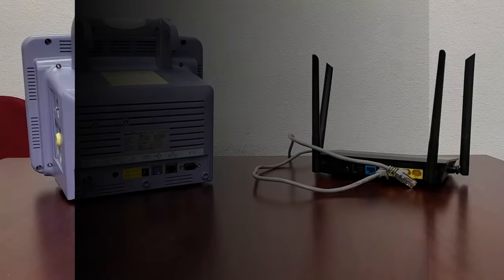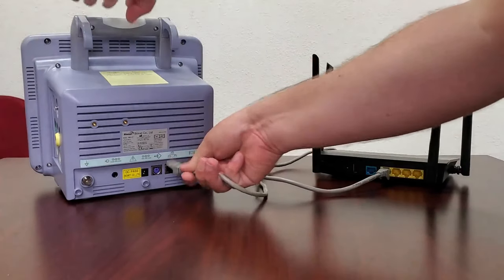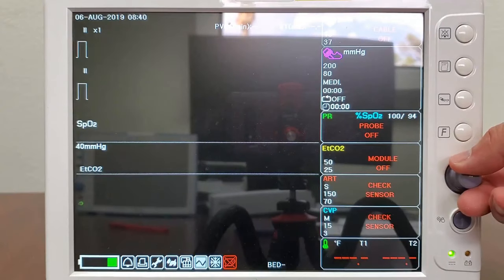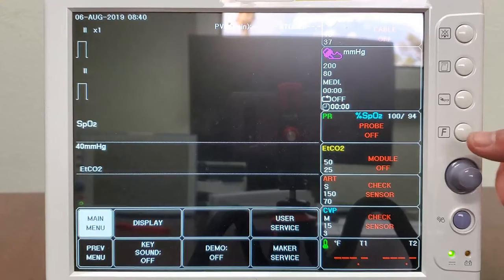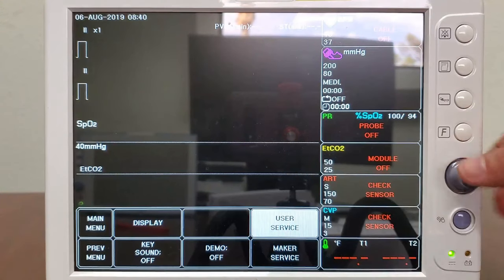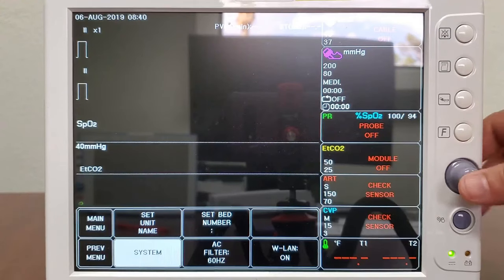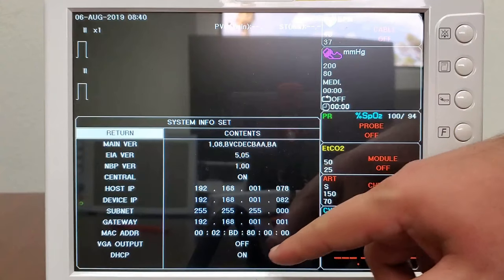Connecting the BM5 VET to B-Link will be very similar to the BM1 VET, but with a few extra steps. Ensure that your BM5 VET is connected to your internet router with an Ethernet cable. From the main screen of your machine, turn the Trim knob until you highlight the wrench icon and click the Trim knob to enter the menu. Turn the knob and click to select User Service, and then System. In this menu, ensure that both Central and DHCP are set to On.